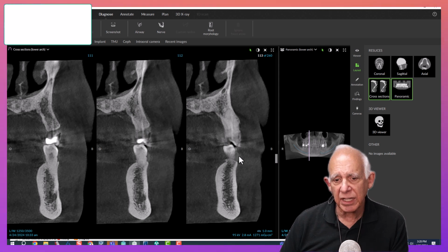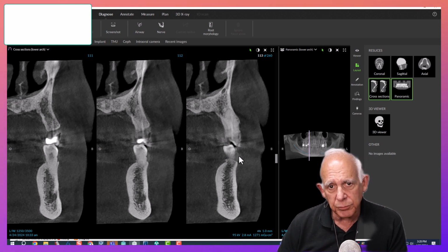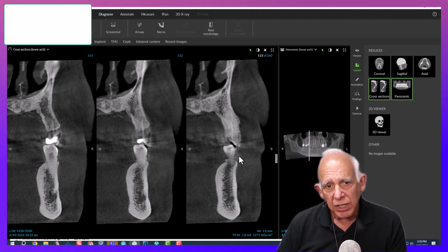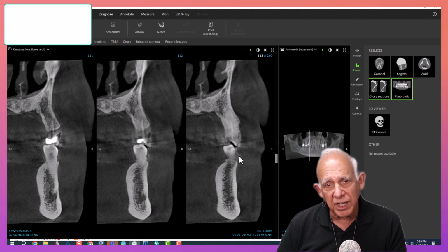We're doing study models. We will look at those study models. We can articulate them through the software. These are scanned. We're not taking direct impressions. And we can get an appreciation as to what we can do to get these teeth into contact before we address pockets or decide on extractions. Imagine the primary contacts are on the second molars only, one first molar, but the second molar is where most of the contact is. What happens if he loses the teeth? What teeth will be in contact then?